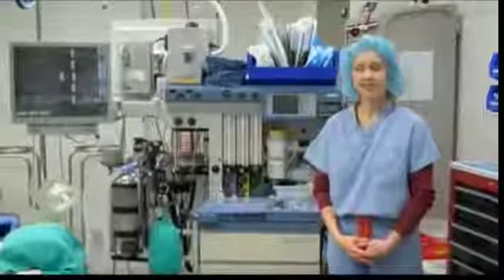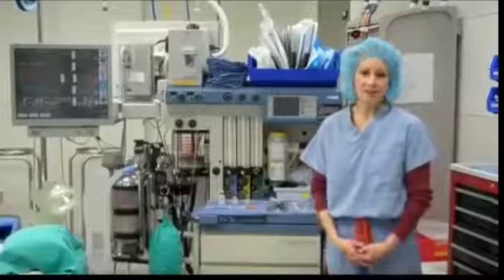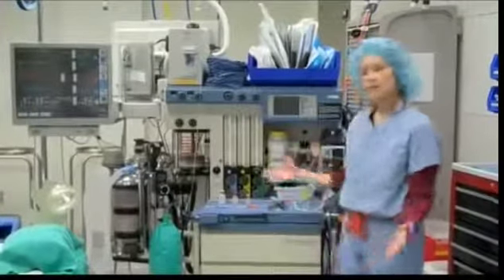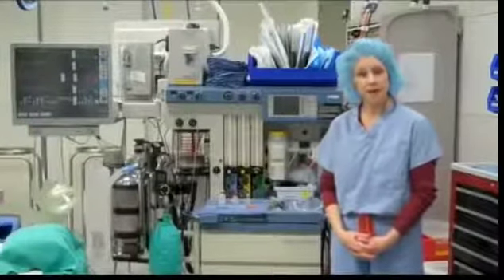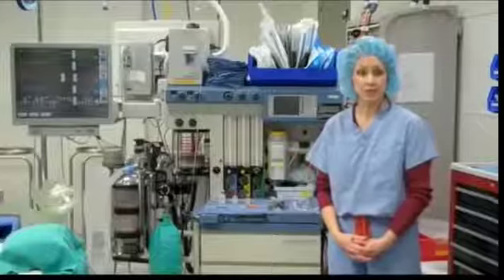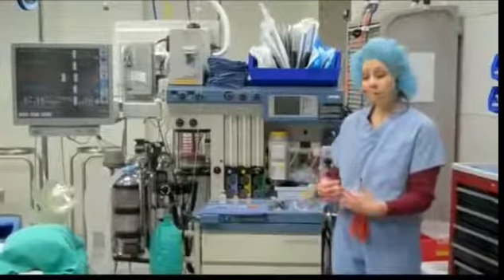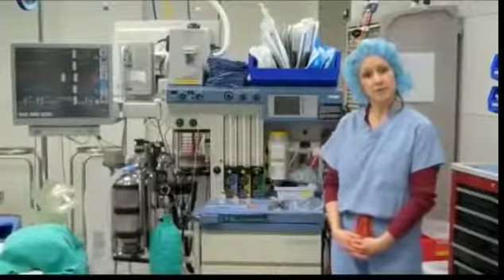Regional Medical Center. And this is our operating room. I would like to take the opportunity today to talk to you a little bit about general anesthesia, about the machinery that we use, and about the medications that we administer in order to provide patients with their anesthetics for surgery. So what we're going to do is walk through how we would go about performing a general anesthetic for a patient coming in for surgery.